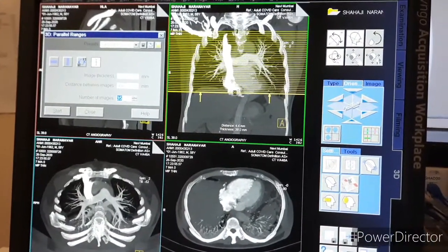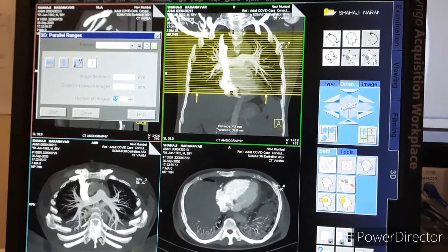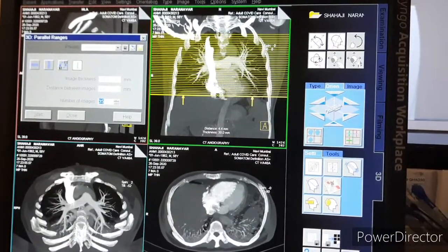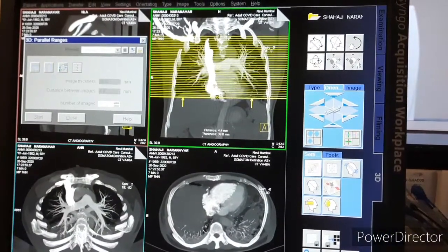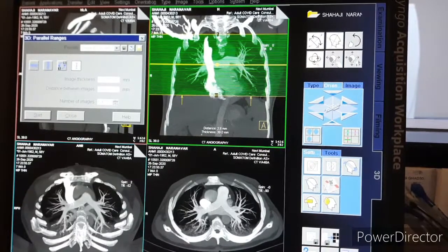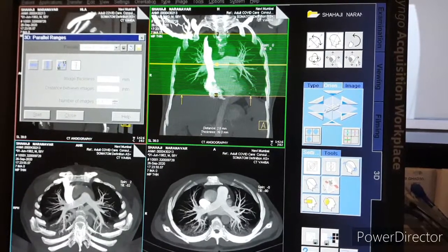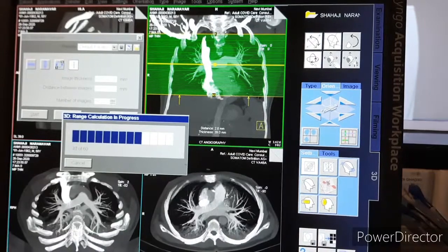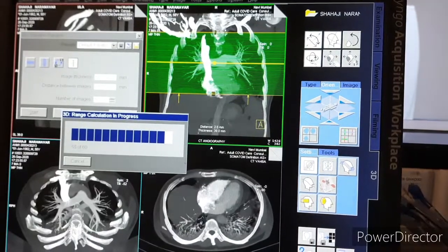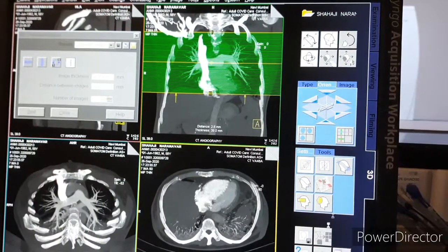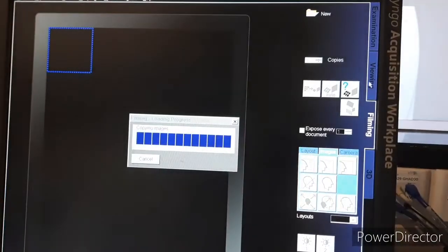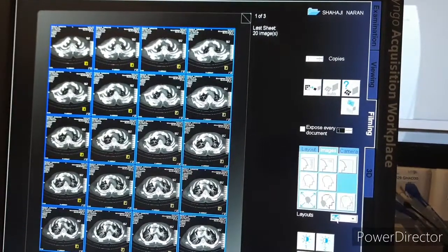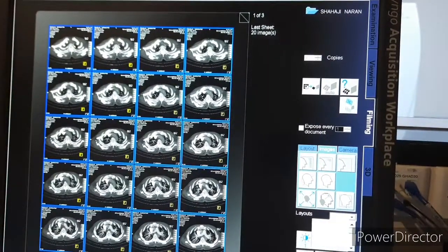The number of images we are generating is 60. You can load it on the film format according to your choice.